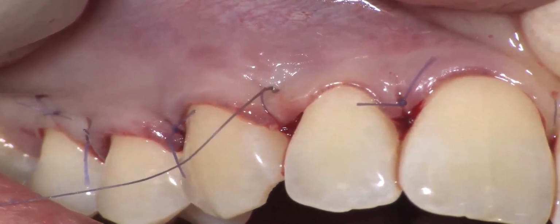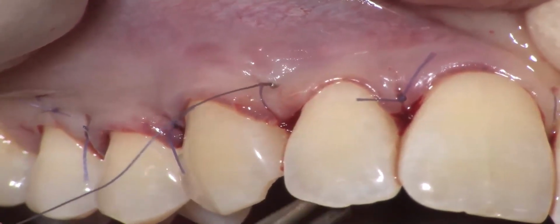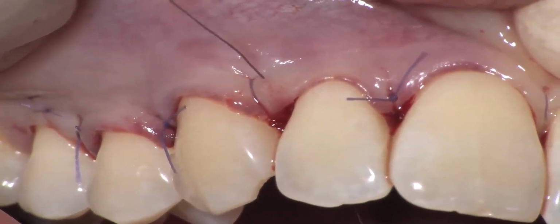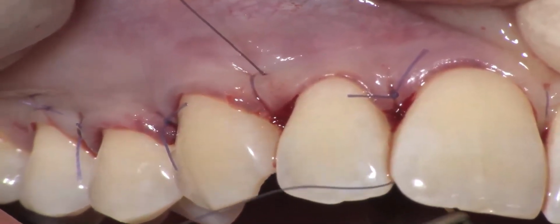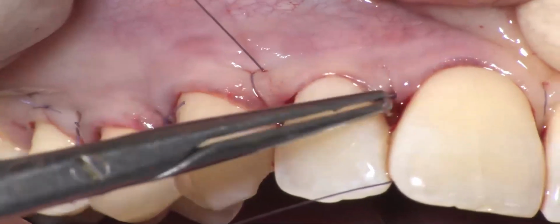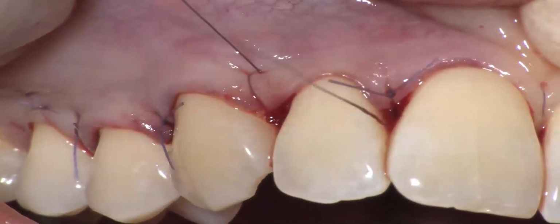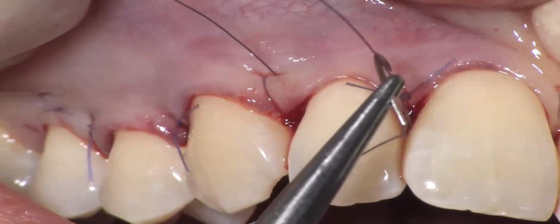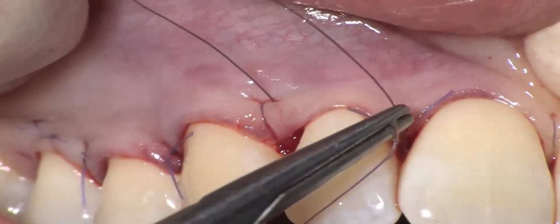Because I want to be sure that the keratinized tissue is in a more coronal position with respect to the material in order not to risk any exposure of the coagulum during the healing phase.